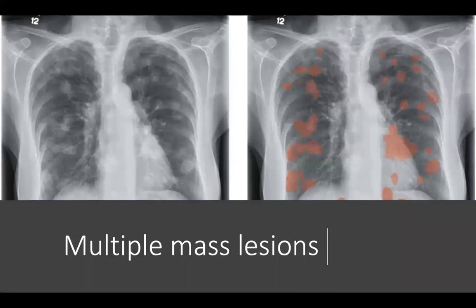The previous slide showed an example of multiple mass lesions. Differential diagnoses include metastasis, seen as usually well-defined nodules of varying sizes; cavitation usually seen in squamous cell carcinomas, sarcomas, and metastasis from colonic primaries; abscess, usually seen as cavitations with thick irregular walls. Rare causes include rheumatoid nodules, Wegener's granulomatosis, and multiple arteriovenous malformations. The two images show a patient with multiple lung metastasis throughout both lung fields, with the metastases marked in red on the right image.